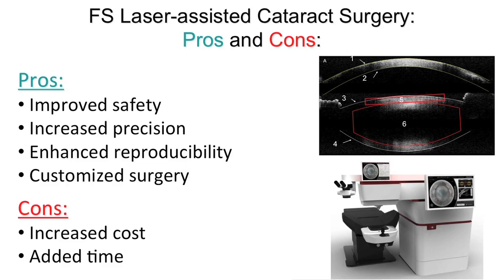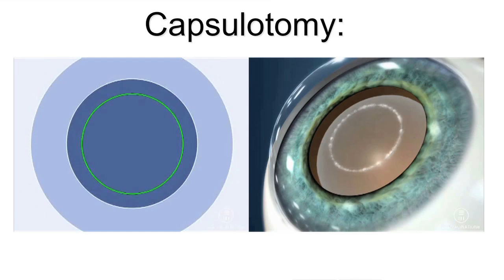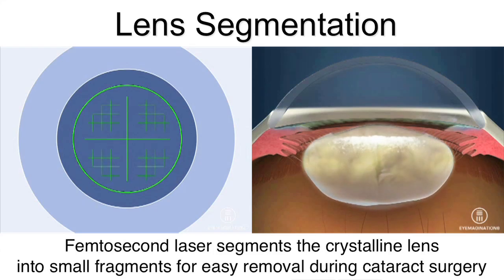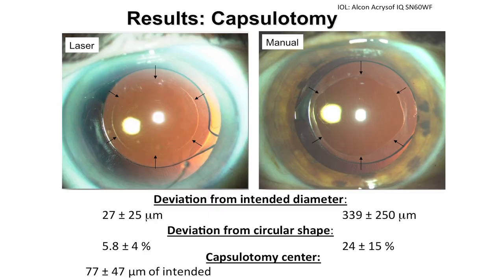Traditional cataract surgery, manual surgery, is limited in precision by surgical skills and by limited visibility of the tissue. Not always is the lens capsule well visible, and this affects eventually the precision of positioning of the intraocular lens and refractive correction. With femtosecond laser, cataract surgery can be executed by prescription, so it will be perfectly centered. The size of the opening in the lens capsule, the capsulotomy, will be precisely determined with a precision of cellular scale, literally. Orders of magnitude more precise than the human hand can do it. And without human error. So with this procedure, and that's probably the most important component, any surgeon can now do cataract surgery as precisely as the best surgeons, and even better, could do today.